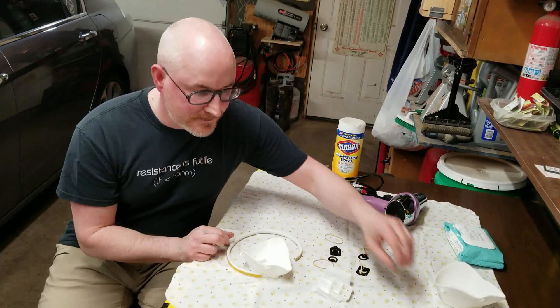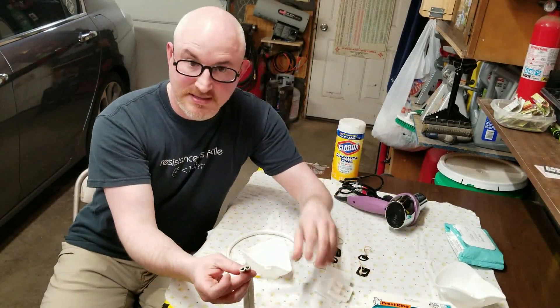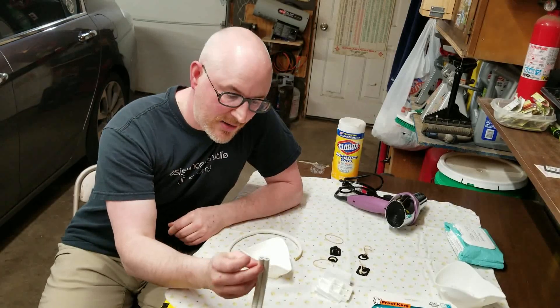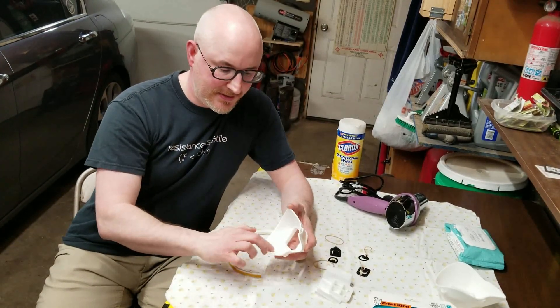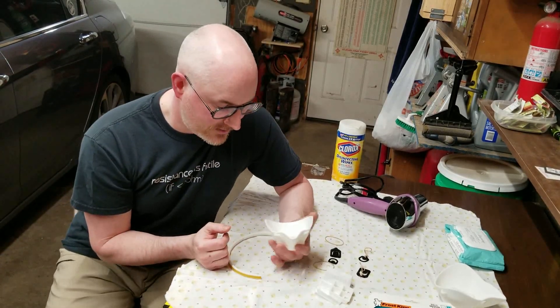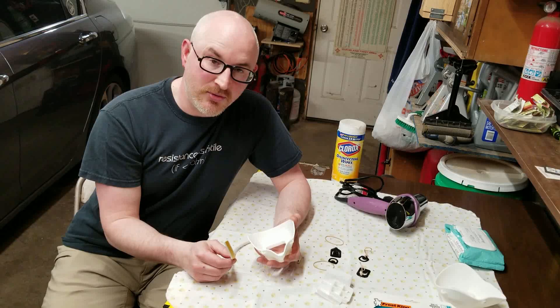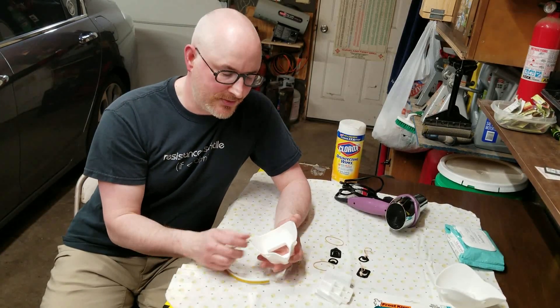What I use is EDPM — it's a foam rubber. It actually comes as a double piece and you might want to use a double piece. In fact, if you look at some of the tests that they did, they applied a double piece around the entire side here just to improve that seal. I feel like you can get a pretty good seal with one, and just to conserve materials at this point in time, I think one's going to be pretty good.